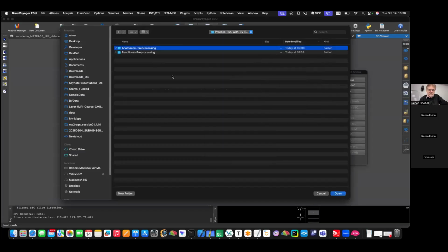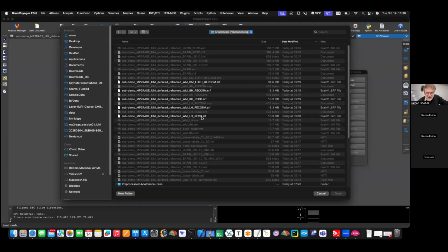There's one little problem. We have them separated for hemispheres. Now I don't want this. I want them combined. The top one is combined. Yeah, I did that, but I want to show how you can do it, right? So the point is, you will not have this. This is one I prepared. Or did we do this already? You have this also? LH? This is the gray matter one. No, don't use this. We need the white matter one. This is the gray matter one. See, it's white matter, gray matter.